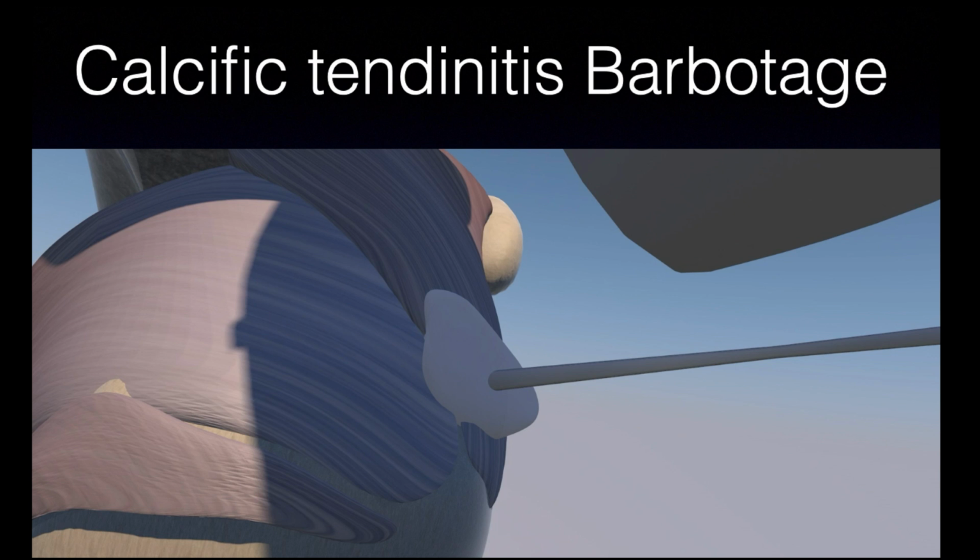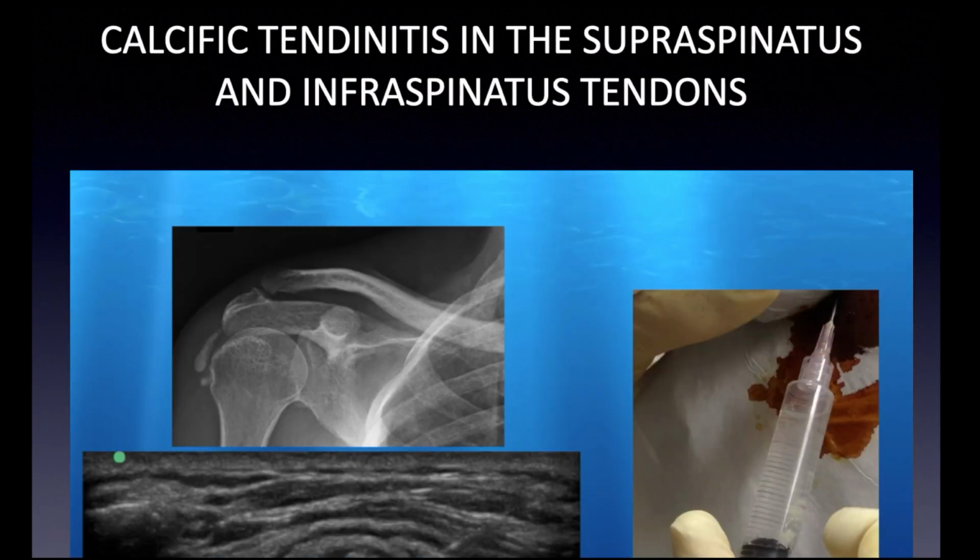Like I had a case not even a week ago, a huge calcific tendinitis. I think it took up much of the supraspinatus and some of the infraspinatus tendons. I had 5 syringes ready. But that was a case where I noticed that it was leaking through the calcific deposit. So I definitely got a fair amount out, but some of it was actually leaking through, so it wasn't a perfectly sealed space. All right, here's one early in my career.